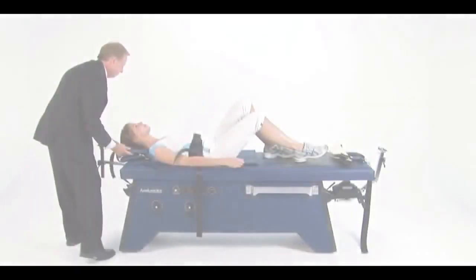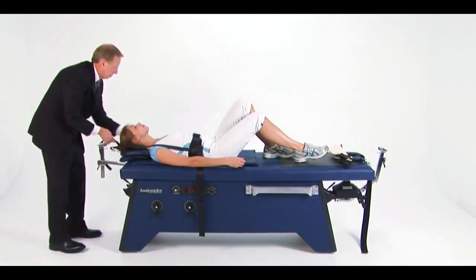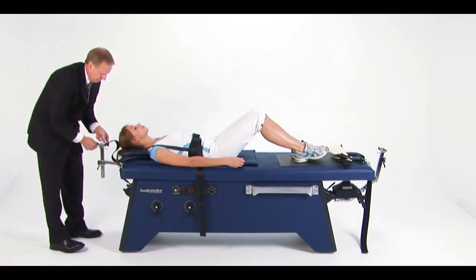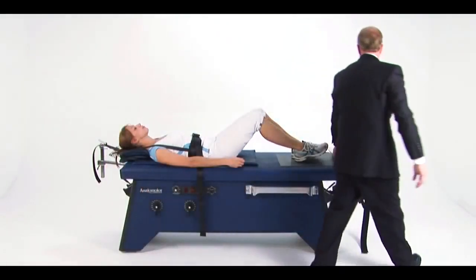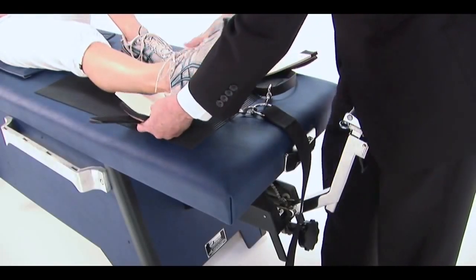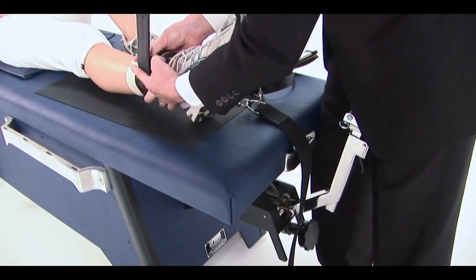A broader form of lumbar traction can be applied using the ankle harness. As before, thread the web strap of the thoracic harness through the counter traction unit at the head end of the table. Wrap the Velcro ankle straps firmly around the ankles. For smaller or more tender ankles, line the harnesses with the rubber inserts supplied. Textbooks refer to this as Buck's traction.